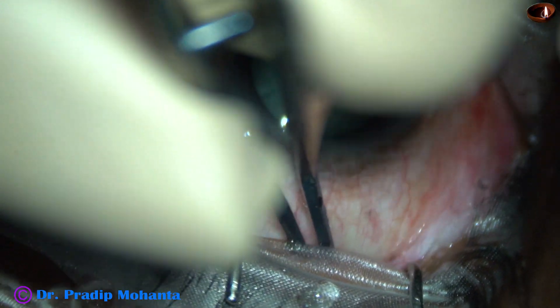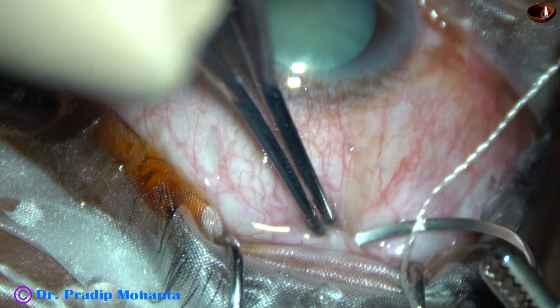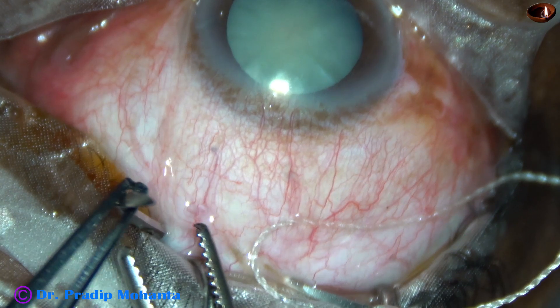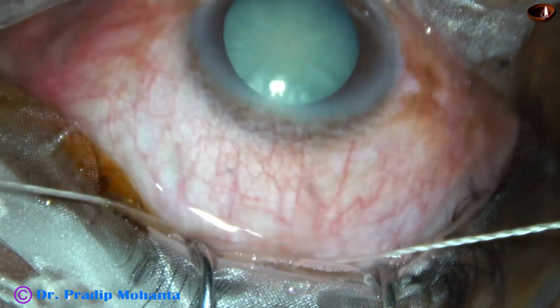This is the superior rectus bridal suture. The eyeball is turned down with a muscle hook. A forceps is used to hold the superior rectus, and then a thick suture is passed beneath the superior rectus tendon.